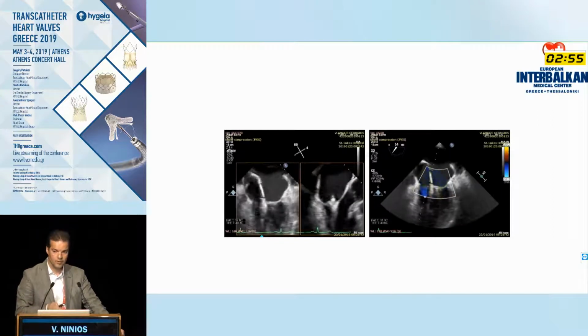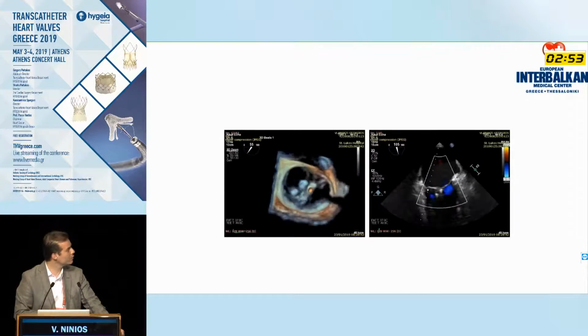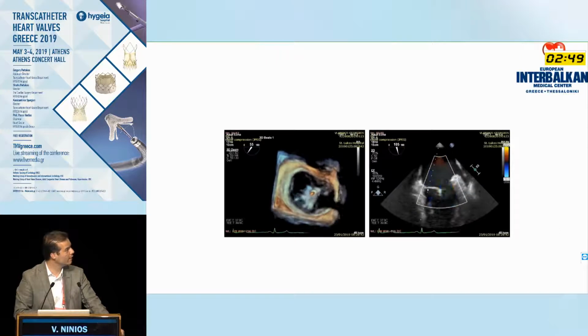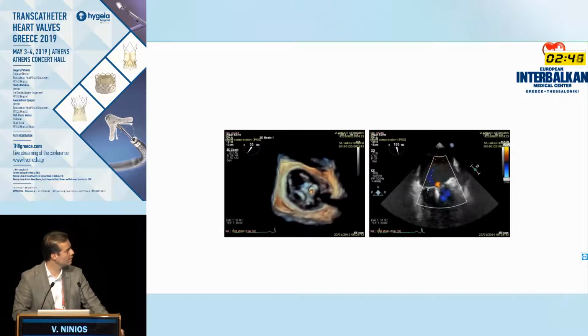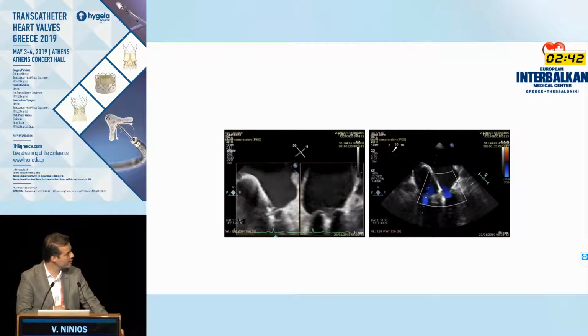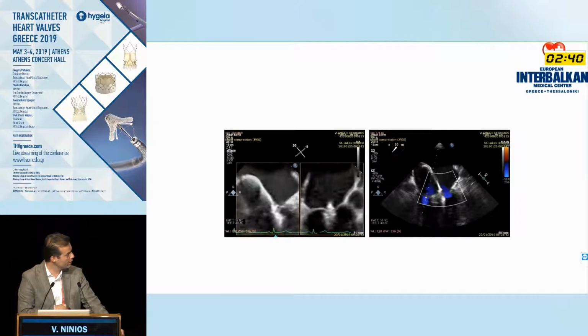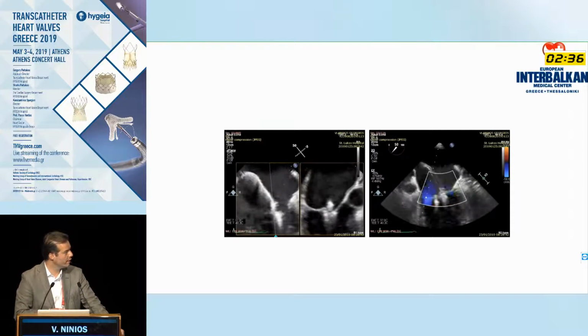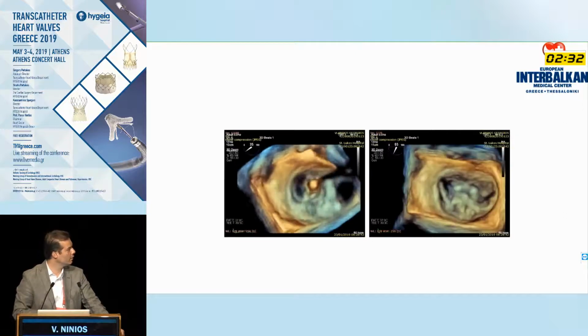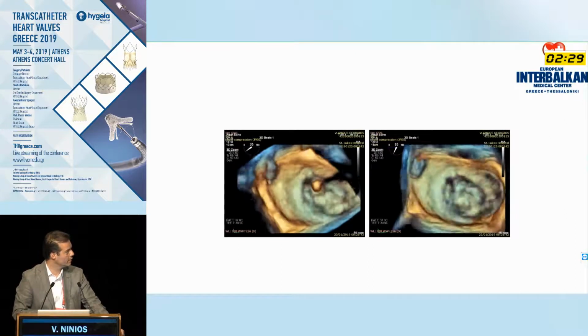But when we looked into the 3D, we didn't like the fact that there was still some residual tissue, even more medially. It doesn't show very well on this. We had an acceptable color, but we decided to go further and just grasp this additional prolapsing part there. And we had a really very, very good result with this whiff remaining. And look at the 3D. We had a very good result.